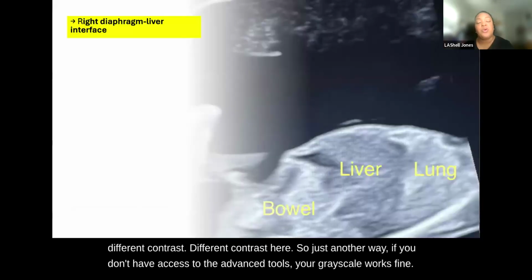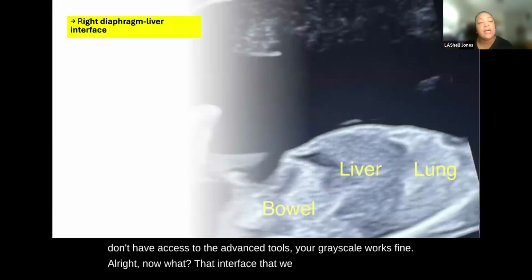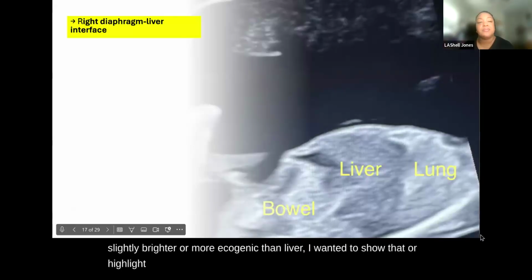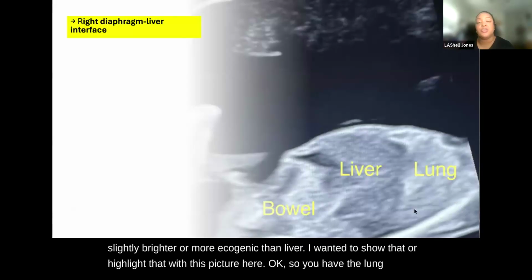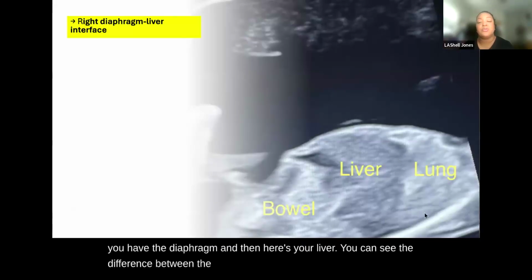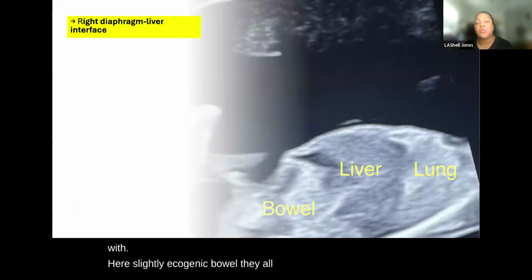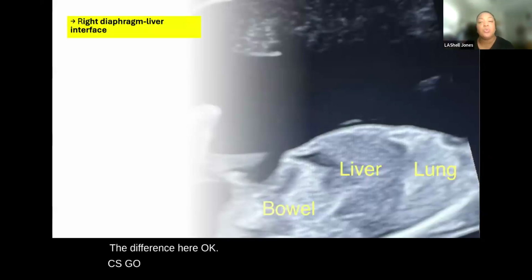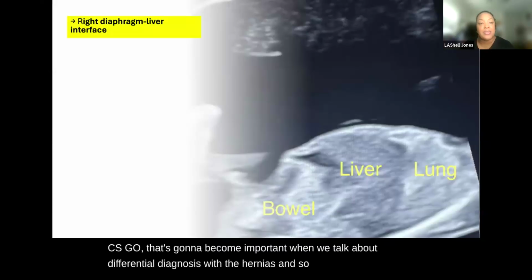All right. Now, with that interface that we spoke of, the lung being slightly brighter or more echogenic than liver, I wanted to highlight that with this picture here. Okay. So you have the lung tissue, you have the diaphragm, and then here's your liver. You can see the difference between the echogenicity, and you can see the difference with the slightly echogenic bowel. They all have different echoes. So I wanted to point that out. That's going to become important when we talk about differential diagnosis with the hernias and so forth. So we'll talk about that in a sec.